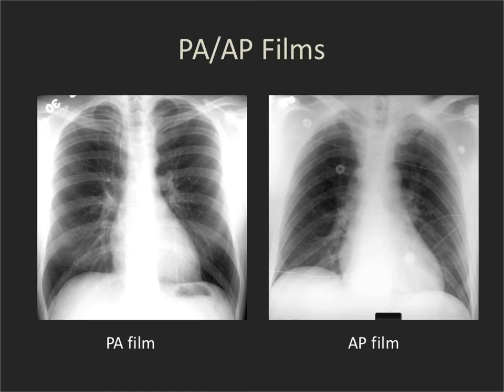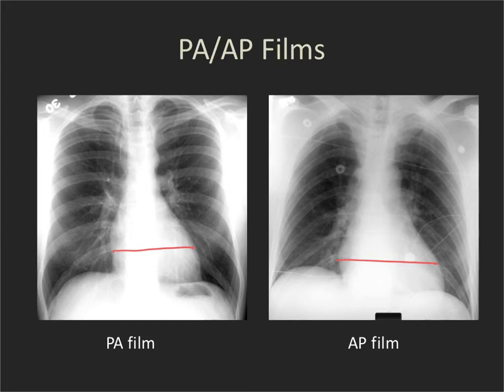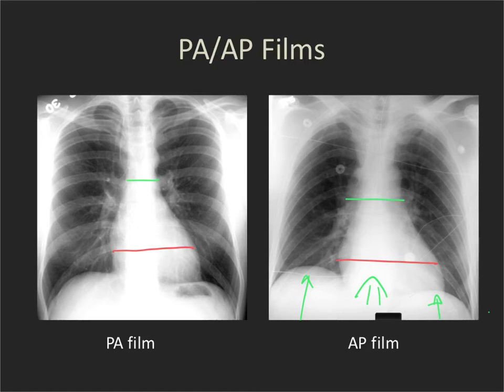These two studies — PA and AP — were done within an hour of each other. The PA was done upright standing, and the AP was done with the patient sitting up on a stretcher in the department. First, the heart looks larger on the AP study from that magnification, so we allow a cardiothoracic ratio up to 0.6 rather than 0.5. The whole mediastinum also looks larger — partly the AP effect, but also because sitting up prevents a full inspiration, which squishes the mediastinum and makes it look wider.